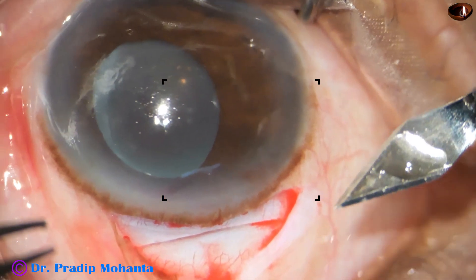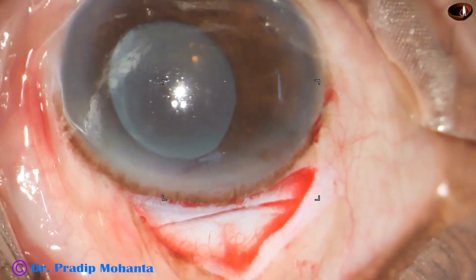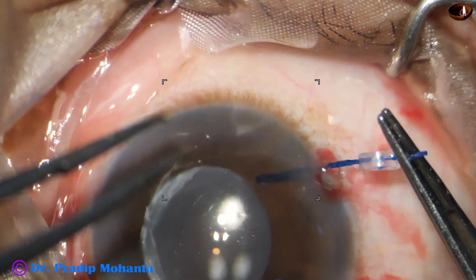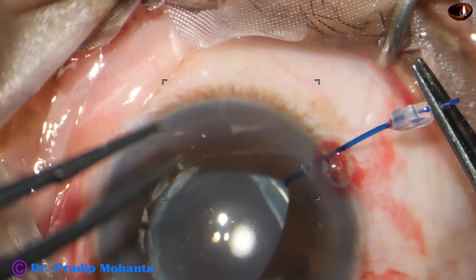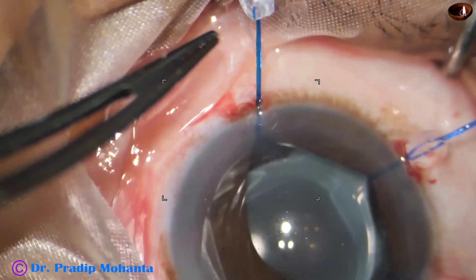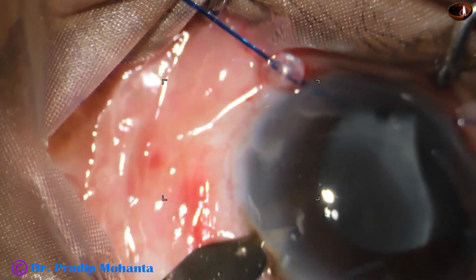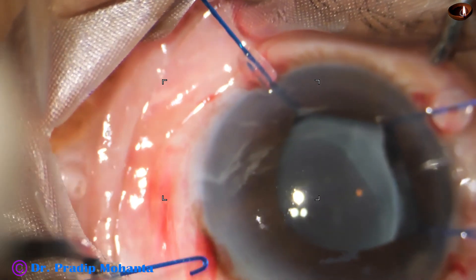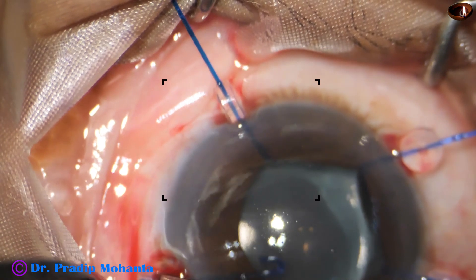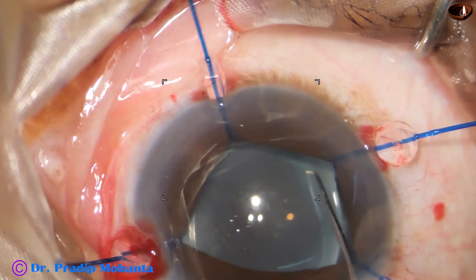Now my plan is to make some stab incisions. This stab incision is a little larger to introduce instruments and maneuver the lens. This is a small stab incision. It hooks the iris and retracts the iris so that I can see the haptics. Another stab wound and one more iris hook at 5 o'clock to retract the iris. Another stab wound at around 1 o'clock and one more iris hook placed here. One more iris hook has been placed at around 11 o'clock and we now have four iris retractors.